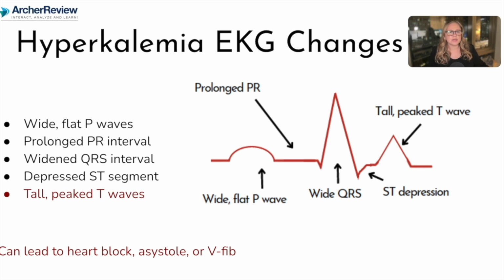The first thing you can expect to see is a wide, flat P wave. Remember, the P wave represents atrial depolarization, the atria contracting and sending that blood to the ventricles. So instead of a short and kind of peaked P wave, we'll see it to be wide and flat. That also means that the interval from the beginning of the P all the way to that R is going to be long, a prolonged PR interval.